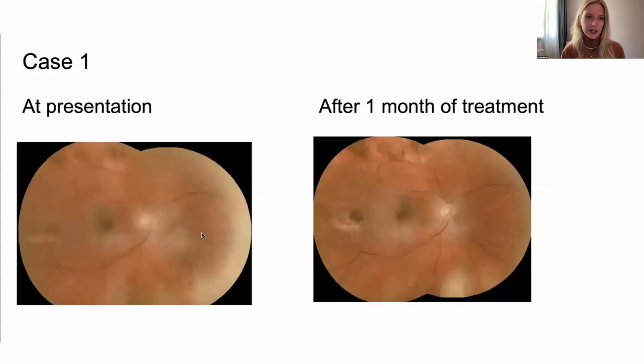So at the presentation, the patient had active disease and was remotely prescribed a treatment. And after 1 month of the treatment, she was again evaluated by the infectionist, and the picture was sent, and we see that the disease became inactive, and the scarring process is already beginning. And this patient saw an ophthalmologist actually only 4 months after the treatment was already started. So this case was managed purely by telemedicine using the ultra-widefield imaging that we are talking about today.